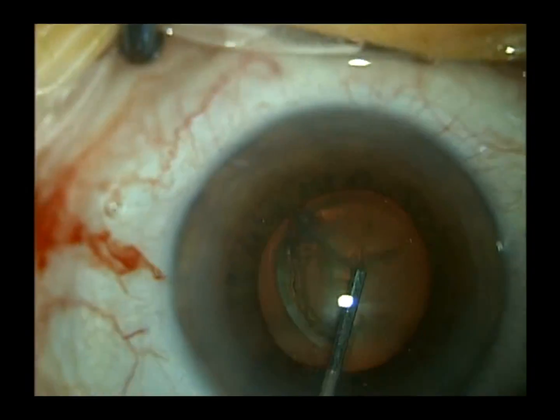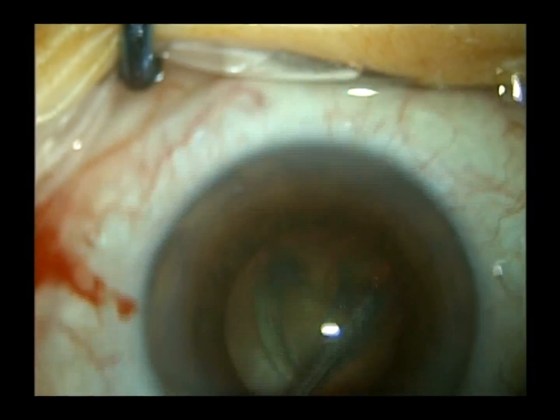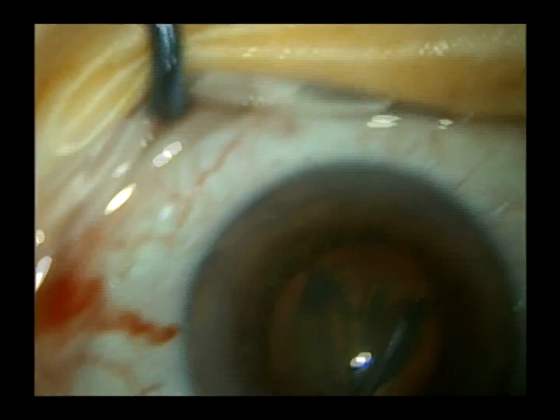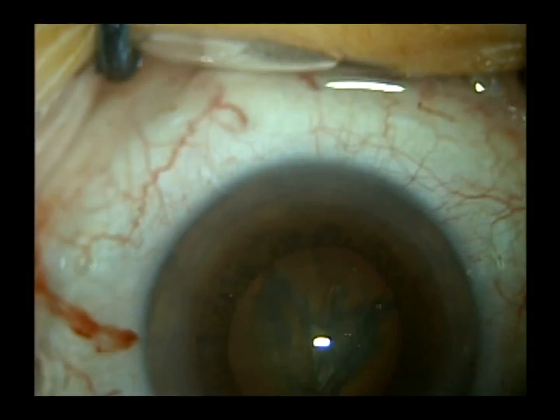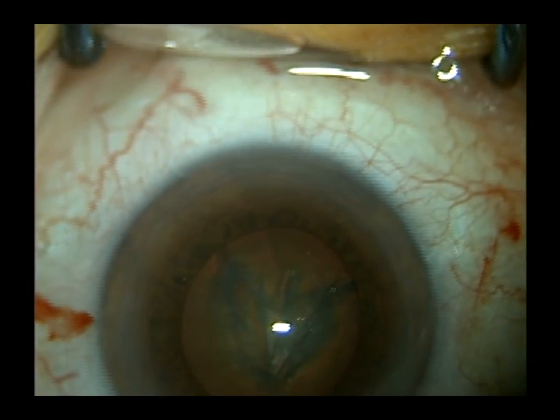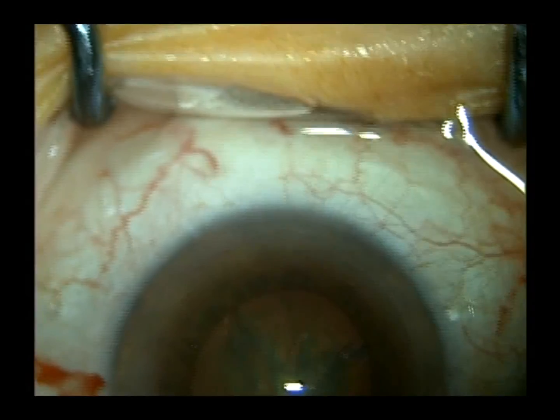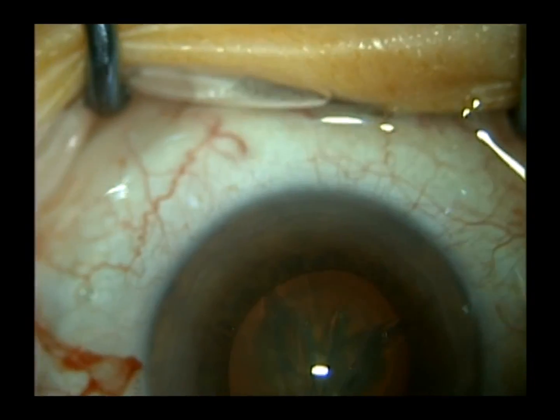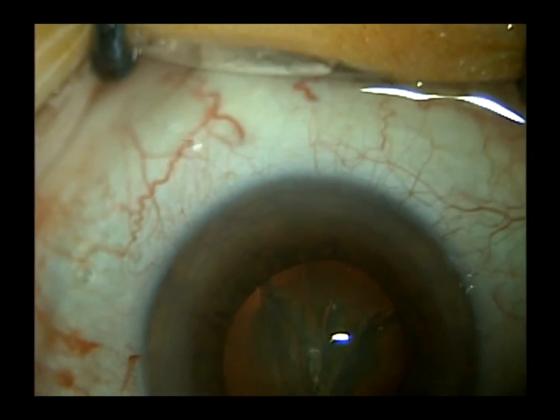This is cataract surgery in real time. It's unedited, start to finish. Usually our cataract surgery times are anywhere from 8 to 10 minutes, but the more challenging ones will always require a bit more time. So now we've got probably a 5 millimeter pupil that we finished our hydrodissection with.